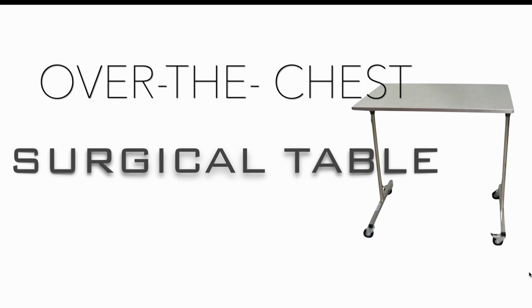To do the surgery right, you need, like we say, the over-chest surgical table, because you can put your instruments in sequence, and when you remove one instrument, the assistant has the possibility and accessibility to return this instrument back to its position without any stress.